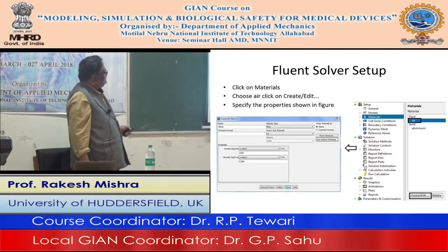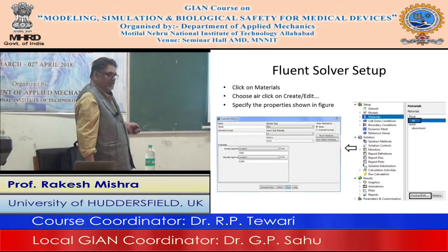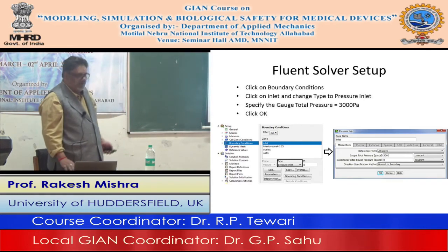So let us do the boundary conditions. In boundary conditions, we are specifying the pressure inlet. Typically it is better for incompressible flows to give one of the velocities as the boundary condition at inlet and pressure outlet. In this case, because pressure value is known, we are using pressure boundary conditions at inlet and outlet. So at inlet I am having 3000 Pascal pressure, and outlet I am having 0 pressure. So this is steady state pressure that we are putting at inlet and outlet.